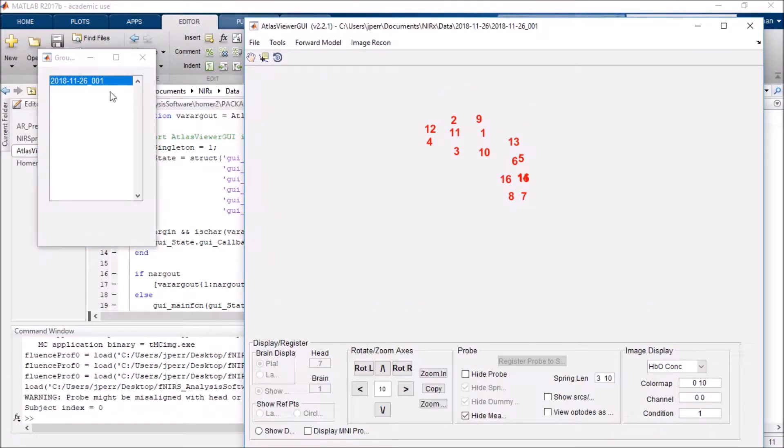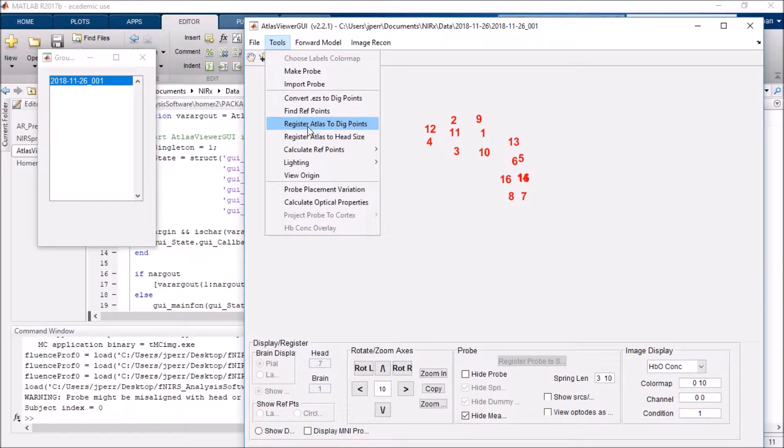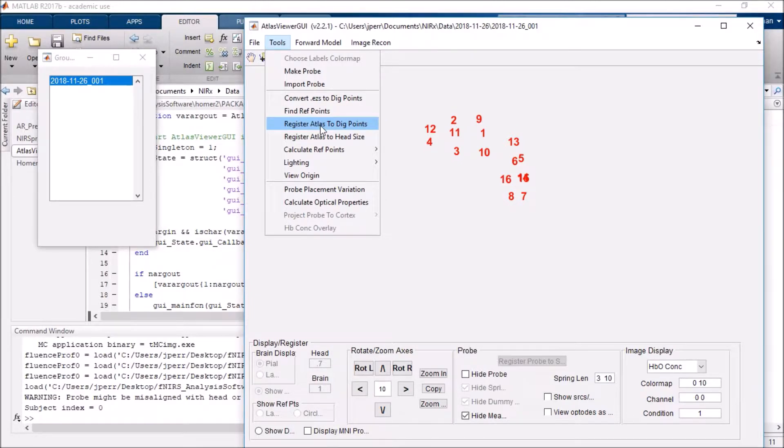So it did already load my file in. It's the same exact file I just used. And you'll also see my points here. If I go to tools, I can register Atlas to dig points. If you don't see this, there's a good chance that your digitized points are not in the format that Atlas Viewer wants.